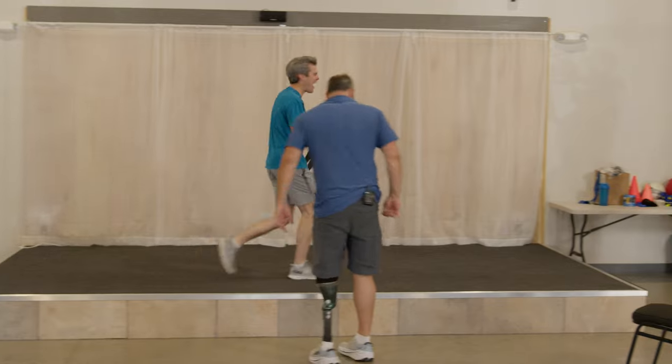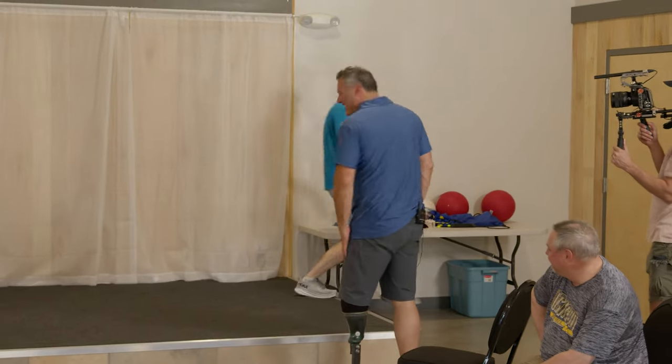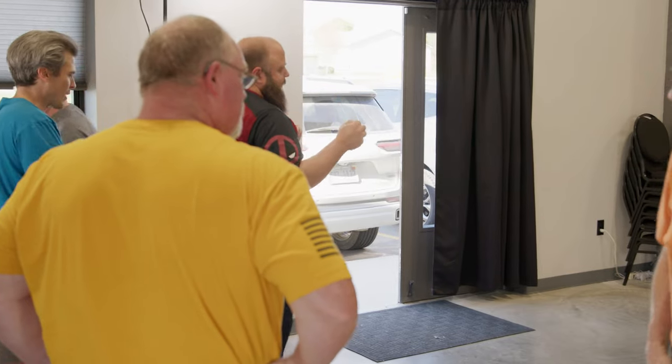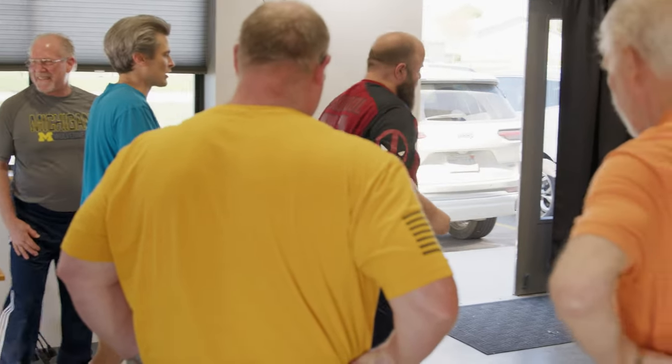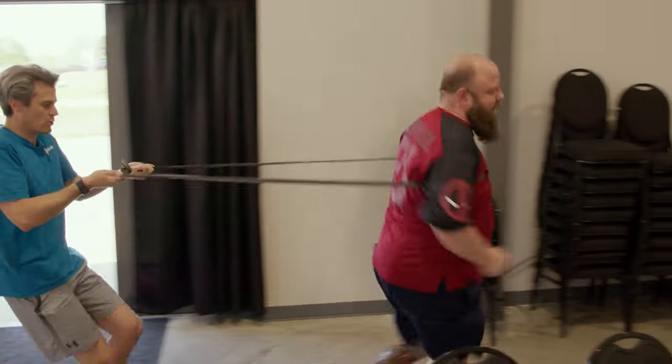Okay, so now Ben, you're gonna want to lean right into it. You can just lean into it like it's the wall. There you go — you got it. Stay on those toes. Good.